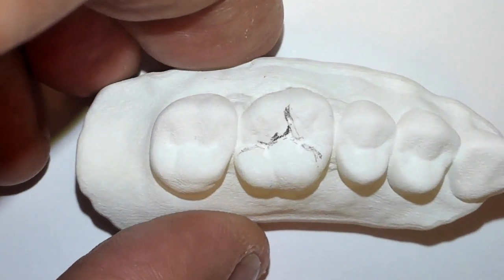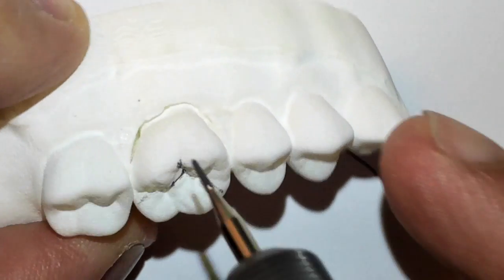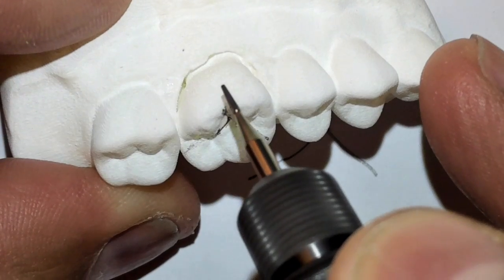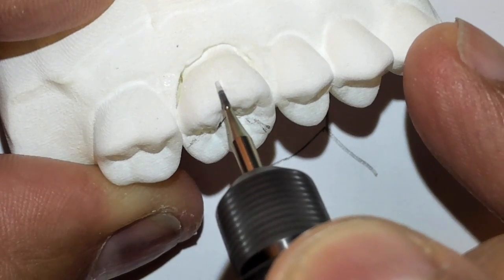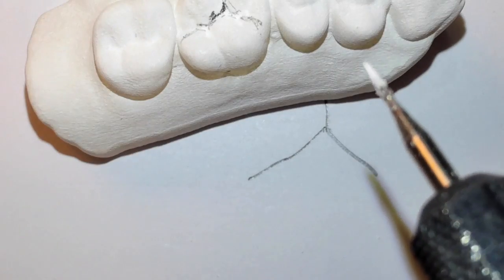The lab has actually given us a nice printed model. We're going to go ahead and utilize our talents — what we know — to remove it. So I'm going to first section the tooth and I'm going to pause for a second.